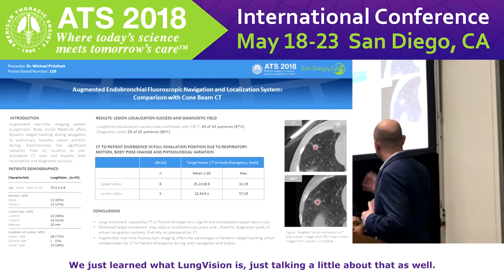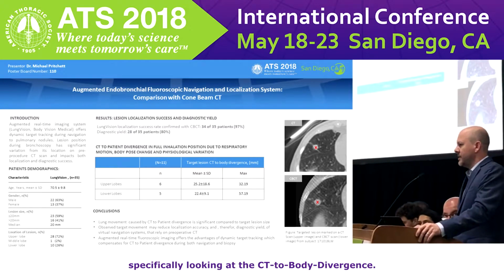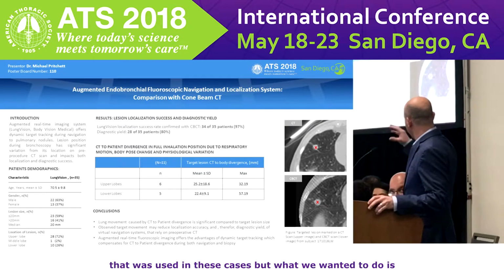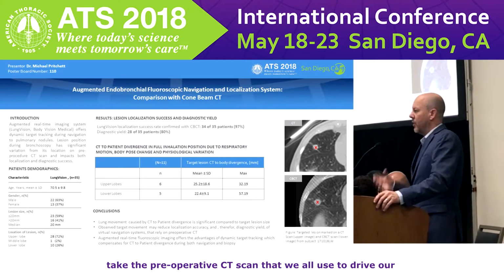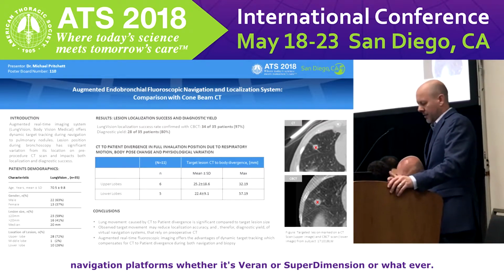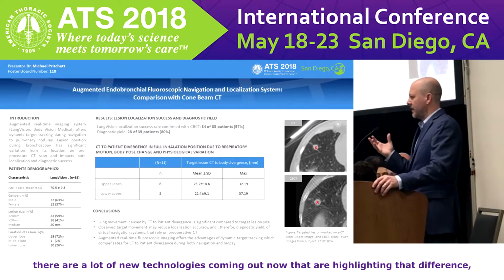We've just learned what LungVision is, and this is talking a little bit about that as well. What we really wanted to look at with this study is specifically the CT-to-body divergence. This wasn't specifically with LungVision, though it was used in these cases. What we wanted to do is take the preoperative CT scan that we all use to drive our navigation platforms, whether it's Veran, Superdimension, or whatever. And so we know that there's a significant CT-to-body divergence.